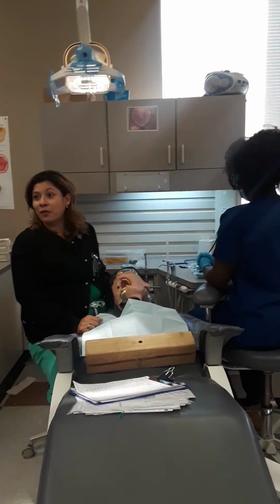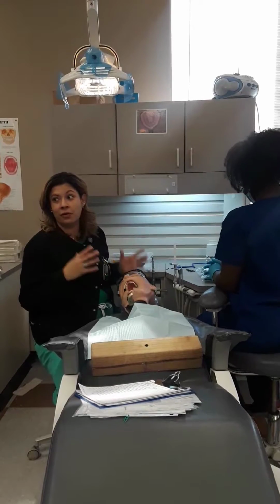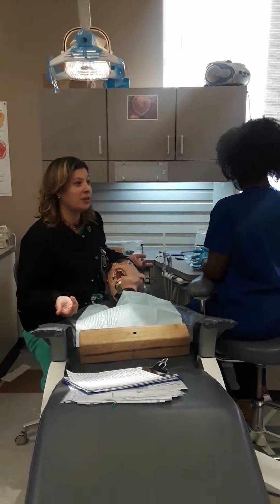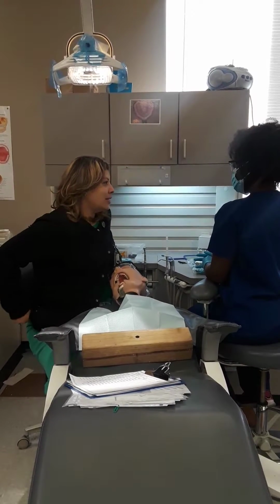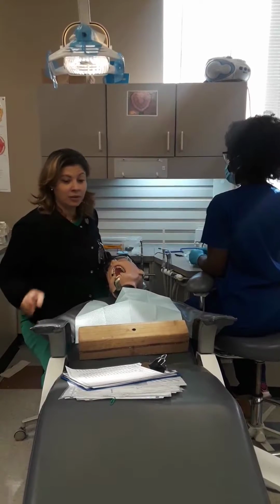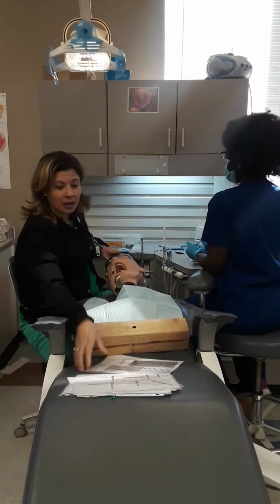If you set up for simple extraction, you're gonna turn surgical. So you always set up for surgical. And then you just put the instruments away that you don't use. So just so you know, just kind of break it apart and avoid that assistant curse because your doctor will throw you a curve, promise.